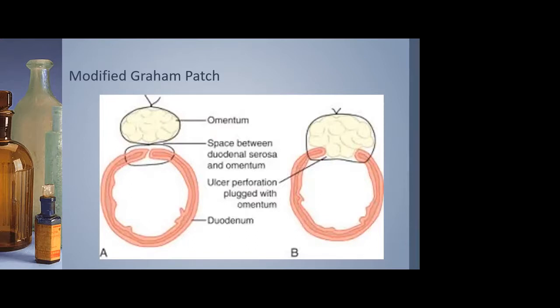We tried to do this laparoscopically, doing the modified, and it is kind of difficult, especially if you're not freehanding it and you use the Endo Stitch. Obviously, you can't just leave the tails there. It becomes challenging. We struggled with it for a while, but if you're using an actual suture needle, you can potentially do it the same way you would open with a modified, where you tie it down, leave the tails long, and then go back and try to do it.